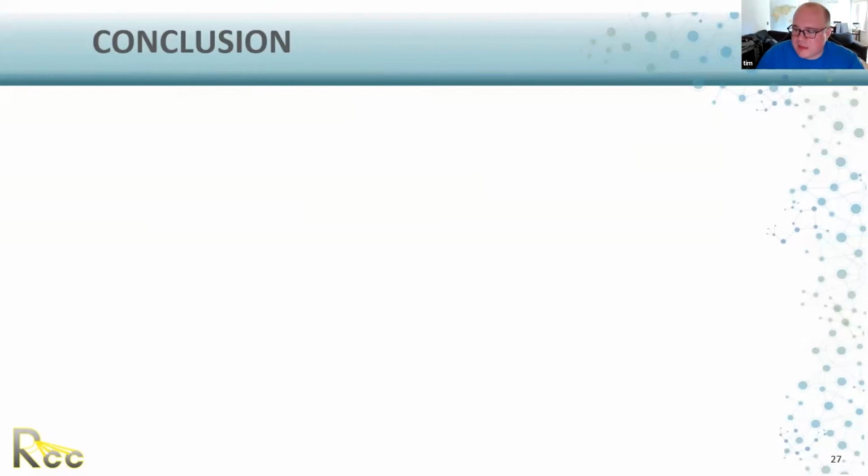Yeah, and then of course the Halcyon's locked to no couch rotations. Exactly. And the 800 per minute dose rate. Yes. So it is possible, but those are limitations, and it sounds like there's some discussion within the community of whether it's a good idea or not. Exactly.